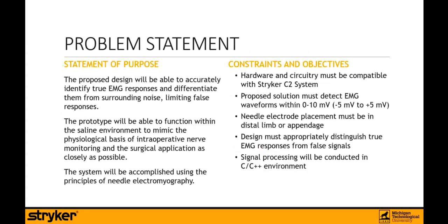Our team was tasked specifically with identifying true EMG responses and differentiating them from surrounding noise, which helps limit false responses. Our team used needle electromyography specifically to accomplish these tasks.